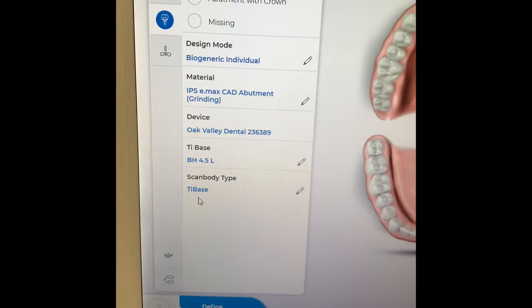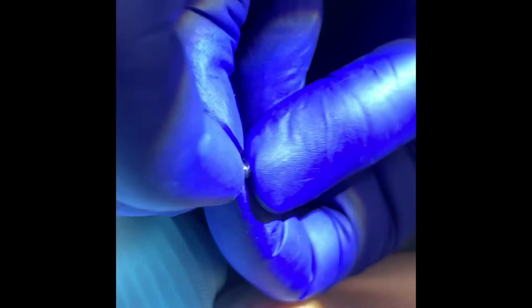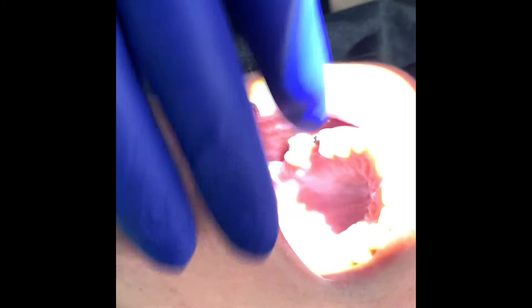That way we can save a little bit of money. So this is the tie base — the crown will actually be attached to this. All we got to do is just kind of get it in the spot. It's always kind of tricky to get on, but you just got to get that hex in there. Once the hex is in, this one's going to work just fine. The screw's already in there, we're just going to tighten it up.